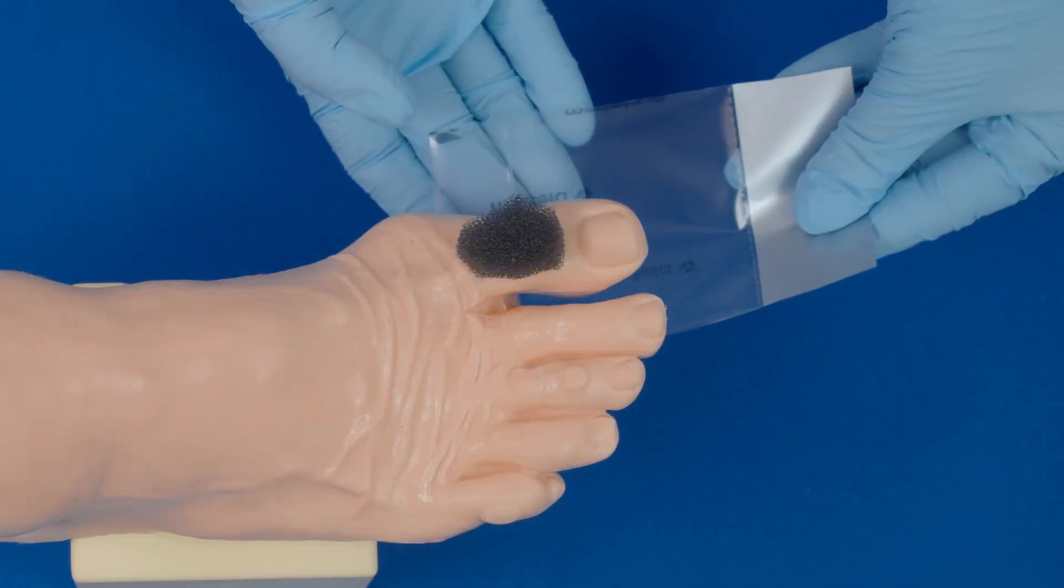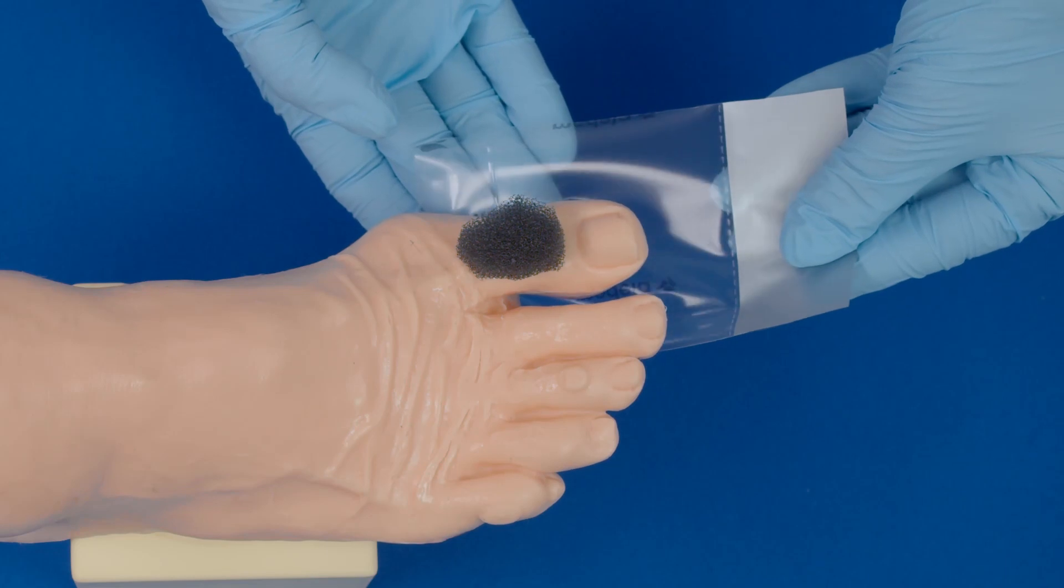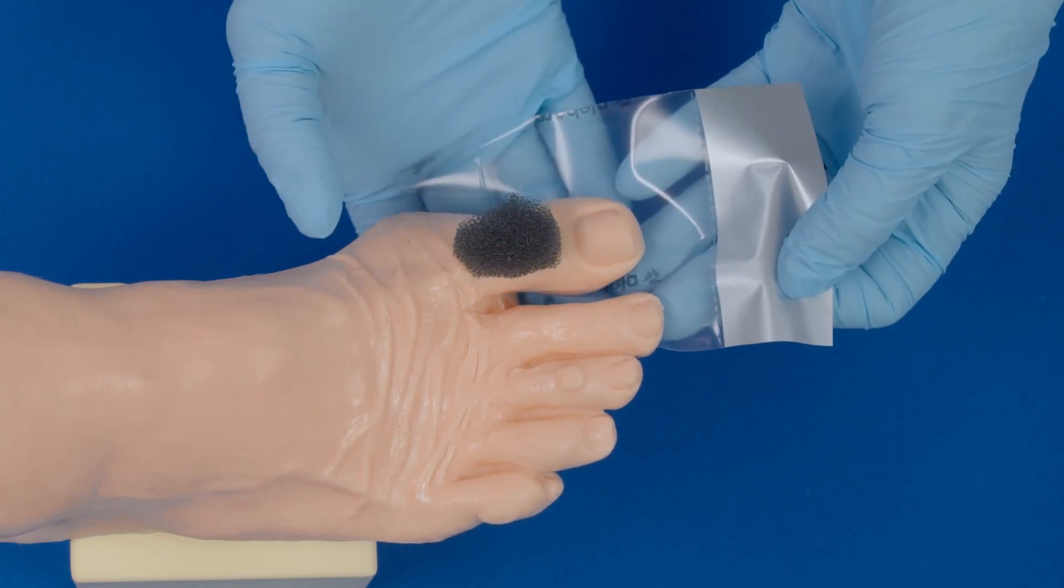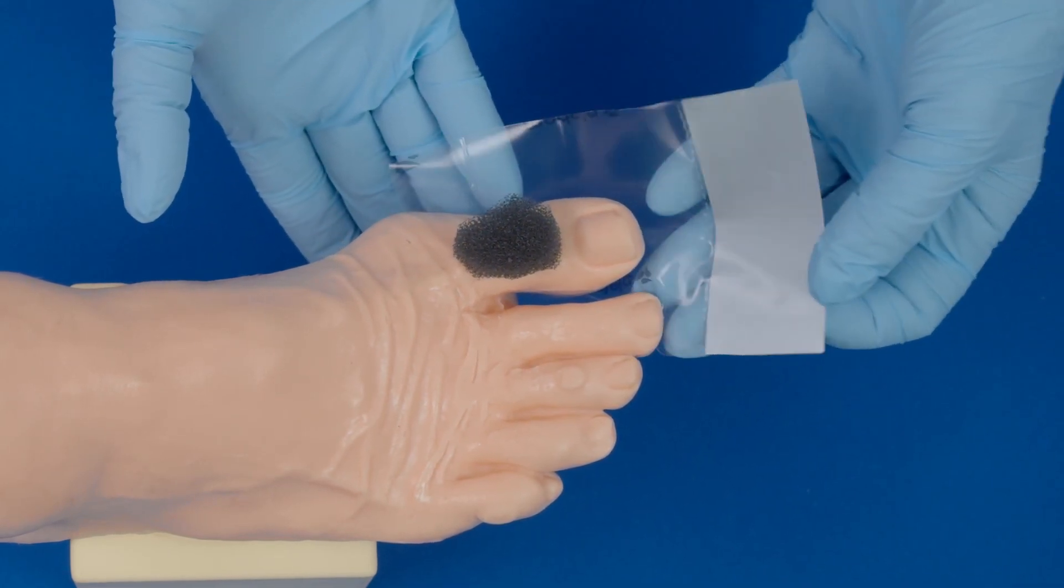Place a piece of transparent film on the bottom of the foot that will cover the wound and toe or toes next to it.